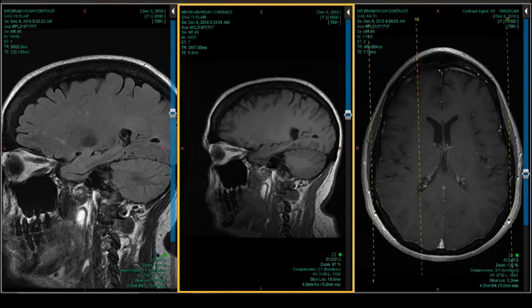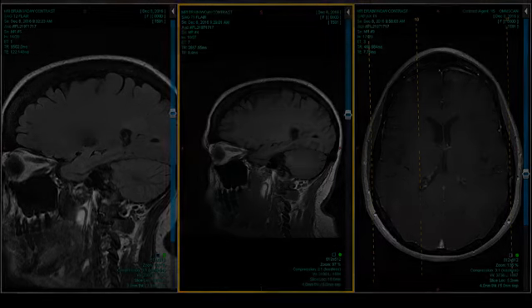Okay, how many scans you see for headaches, all right? So, sure, garden variety cerebrovascular disease related to these other things is going to be a lot more common, but this is in there in the female patient, particularly if it's severe. And a young woman, looks like MS, got headaches. That's got to be on your list, or you're going to miss it. Right. Let's go on to the next case.